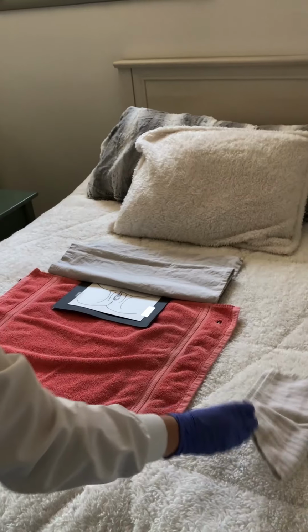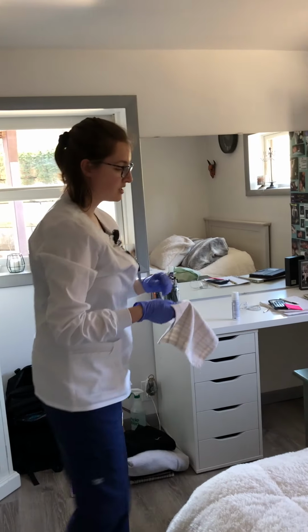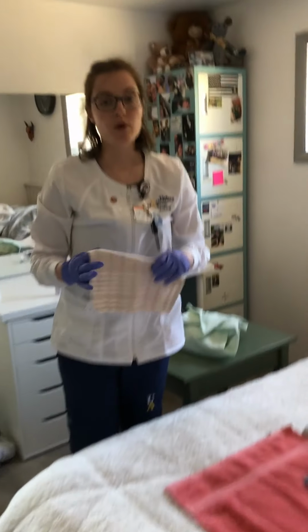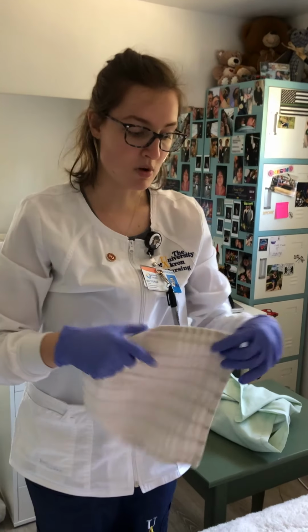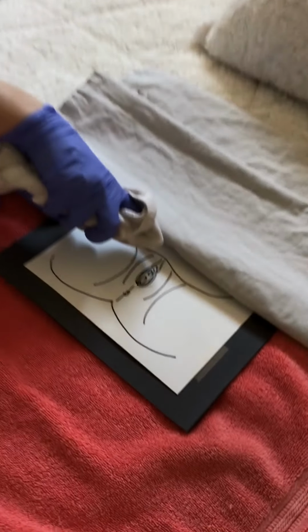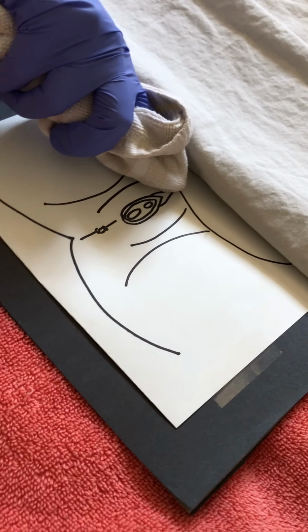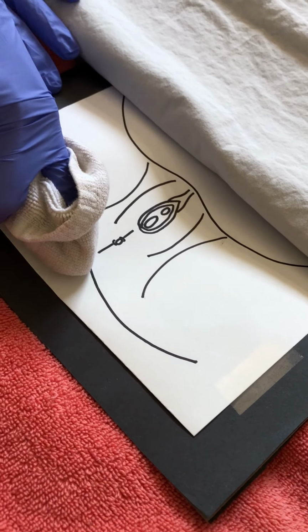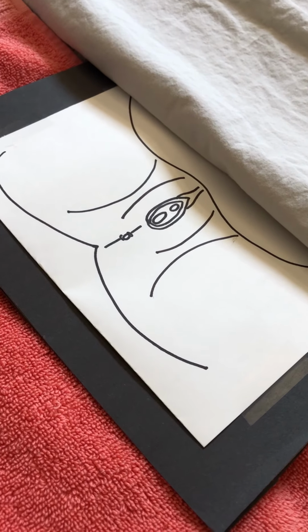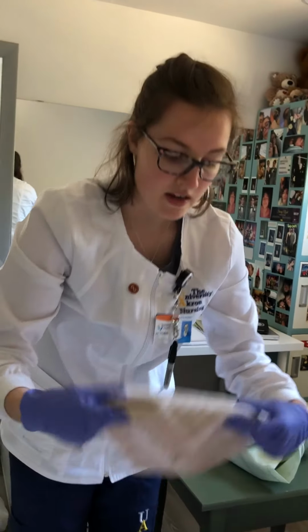Okay, so then the next thing I'm going to do is clean the patient's perineum with warm soapy water with just a simple washcloth. Okay, so I'm going to take one corner and wipe from top to bottom, going from the top to the rectum. So one swipe down, then use another corner of the washcloth and do the same thing on the outer edges of the labial folds. Okay. All right.